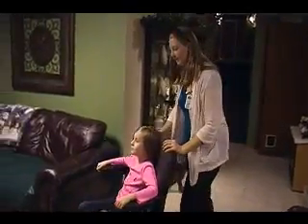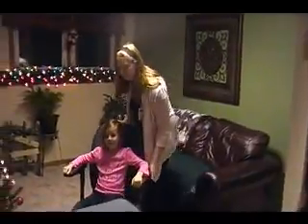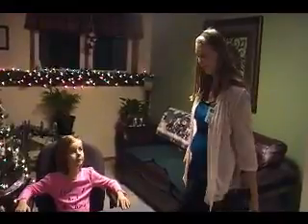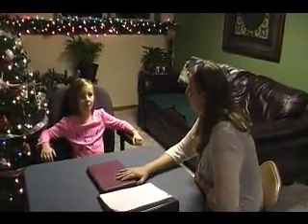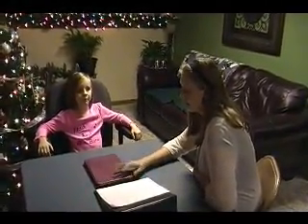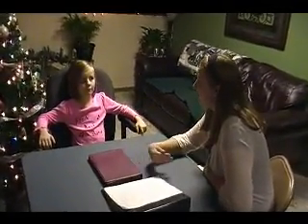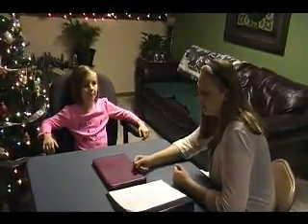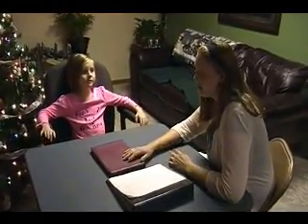Alright, Sean, we're going to go ahead and get started today. I'll wheel you over here to our table. Alright, just to let you know, I have a little bit of a cold today, so my voice is going to sound a little froggy. But today we're going to be working on the iPad. I brought that here for you. And we talked about this last time you were here with me. And you talked about having some difficulty getting across what you wanted to say to your parents and stuff. So we're going to work on that. I'll show you some examples, and then I'll talk to your mom and dad a little bit about how much it costs and stuff like that.